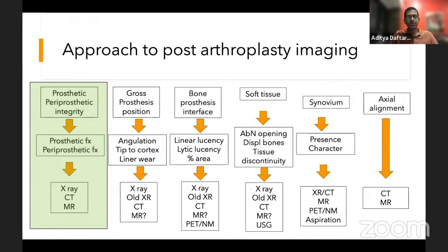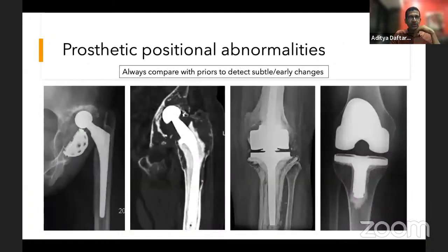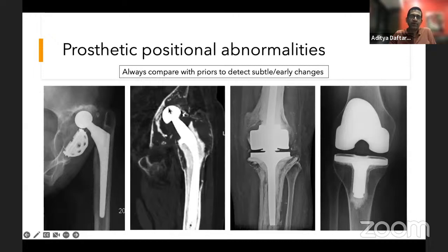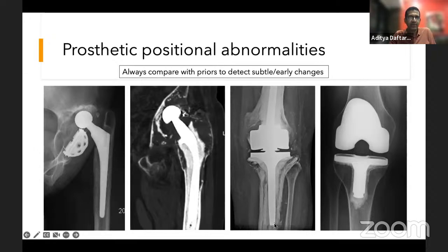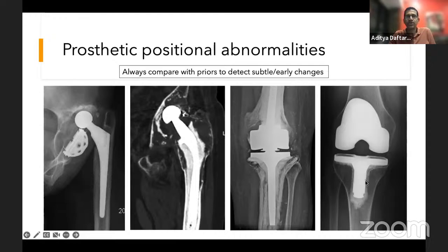Next we talk about gross prosthetic position. When you see angulation or positional abnormalities, it should trigger concern — especially when you see a trend across multiple radiographs compared to the immediate post-operative film. You can have gross positional abnormalities like complete cup displacement, or more subtle findings like superior migration of the femoral head within the acetabular cup, or the tibial stem tipping laterally and abutting the cortex.